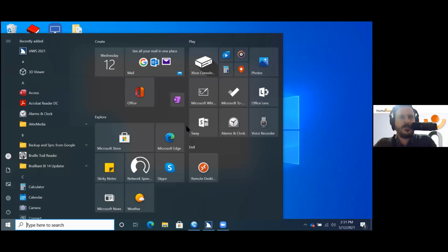The other one that is very widely used is the menu bar. How do I get into my menu bar? Yes, you could press Alt on the keyboard. Space with M will also do it. So if I'm in Microsoft Word and I press space with M, I will pull down those ribbons and I can start moving through those menus. There are also ways to emulate Tab or Shift Tab or Home or End or anything.